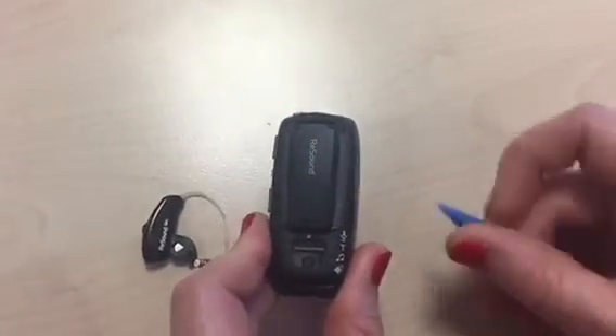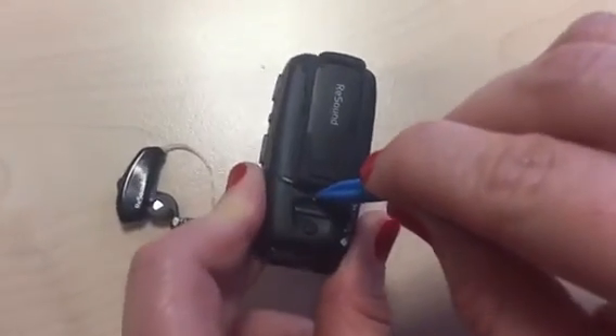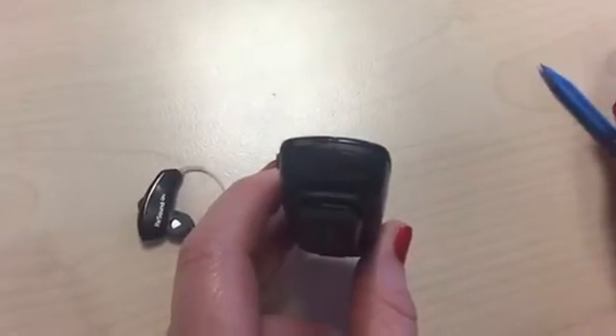Turn over the multi mic and on the back you will see a white circle. Simply press the button once firmly and you will note that the light on the top flashes orange.